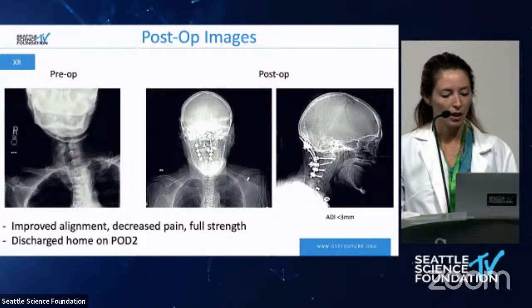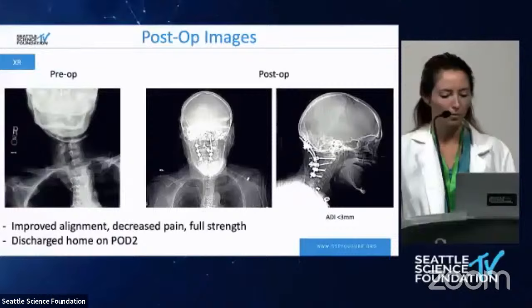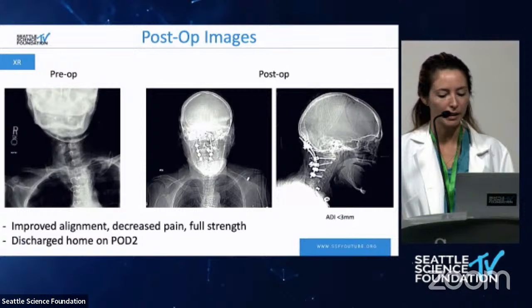So post-op, the patient looked like a different person. I had to use the scout films from the post-op CT, but you can see the improvement of her head alignment. Her ADI was normalized. She was up and walking the next morning after surgery. She went home on post-op day 2.